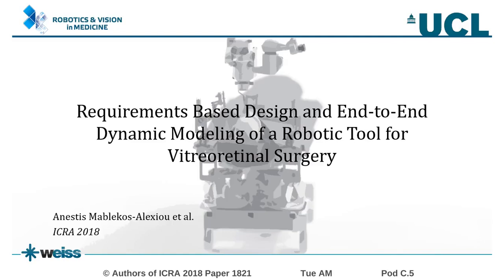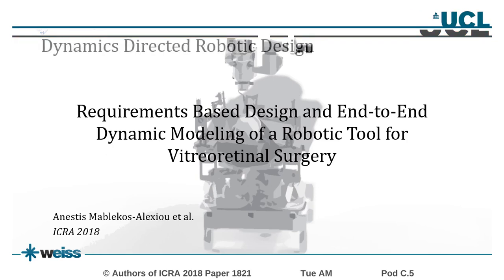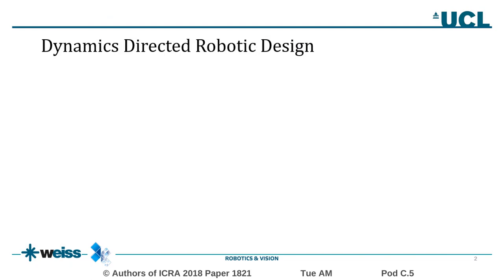I'm a PhD at the Robotics and Vision in Medicine Lab at UCL, and this is a short introduction of our ICRA 2018 paper, which is about the requirements-based design and the end-to-end dynamic modeling of a robotic tool for retinal surgery. So as the title indicates, our work is mostly about design, and more specifically, we present a design process which is directed by the dynamics of the robotic manipulator.